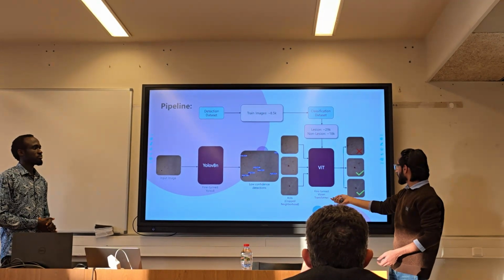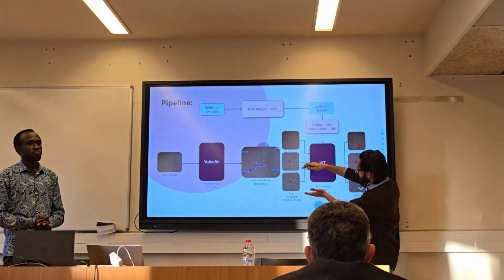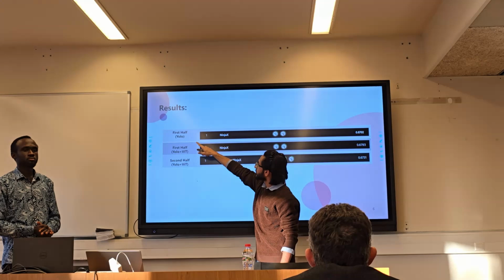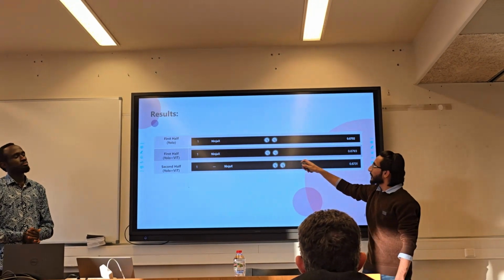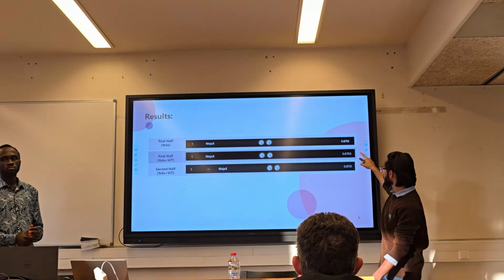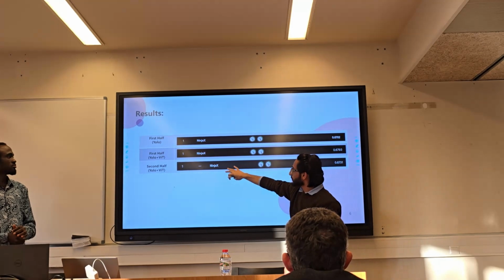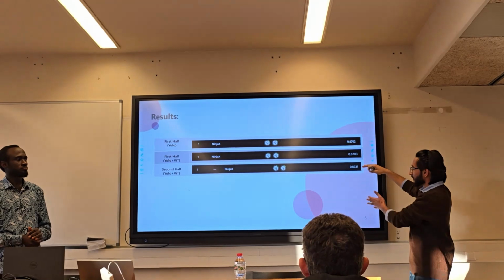So our ViT helped us to classify these neighborhood-grown ROIs. First with YOLO, the best model, we were getting around 67.02, and then when we added that ViT to our pipeline, we received almost a 1% increase in our mAP. When this model was tested on the second half of our data, we got stabilized results.